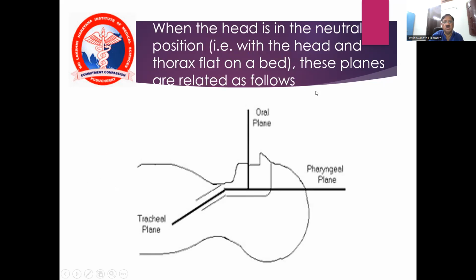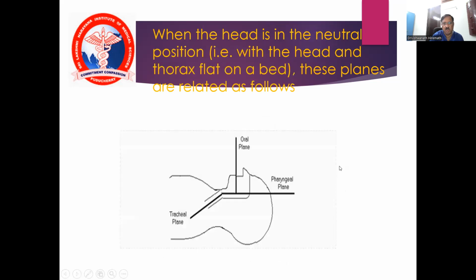And the head is in the neutral position, thorax flat on the bed. These planes are related: the tracheal plane, pharyngeal plane, and oral plane.